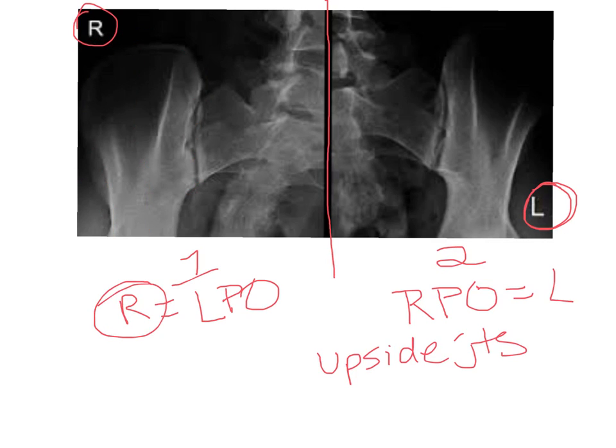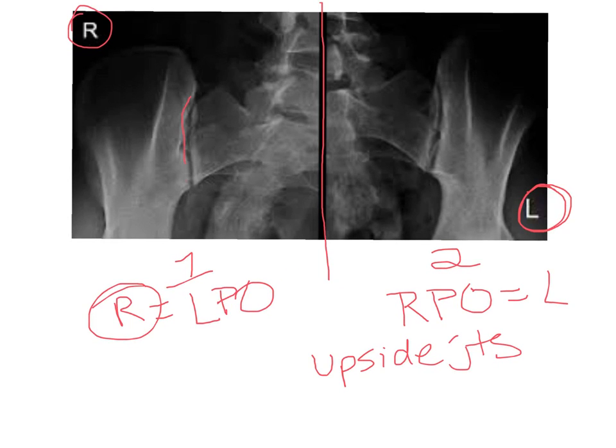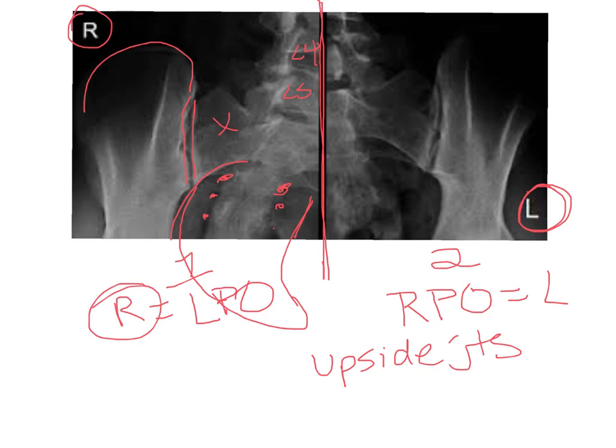As far as anatomy goes, we've already been through most of the anatomy here. These aren't the greatest images to look at. You have your right SI joints coming through here, your iliac crest, pelvic brim. This is the wing or ala of the sacrum here. Now remember, these are two separate projections, okay? And you've got L5 and L4 here. The sacrum is coming down along this way. If we were to see all of it, it's going to look curved like this. These little areas here are sacral foramina. And again, your median sacral crest.